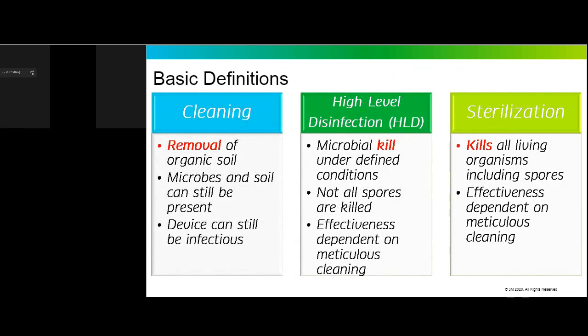So today's focus is on steam sterilization and sterilization monitoring in the clinic setting in this particular session. But I wanted to ground our conversation with a few basic definitions first. Let's think about cleaning. What does cleaning achieve? Cleaning is the process for removing organic soil.